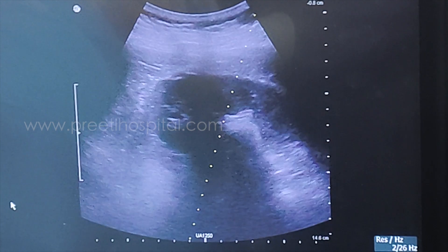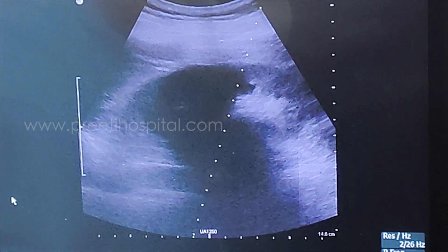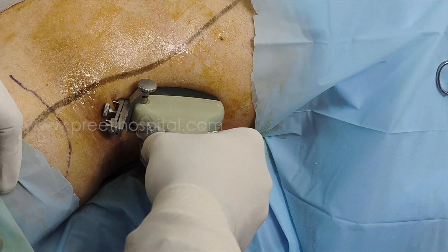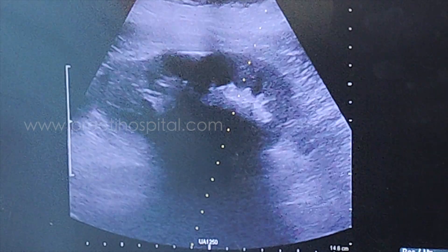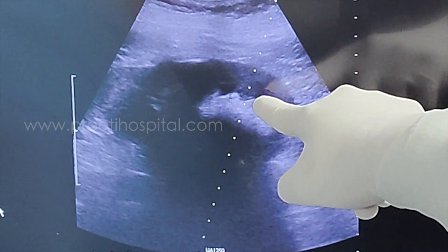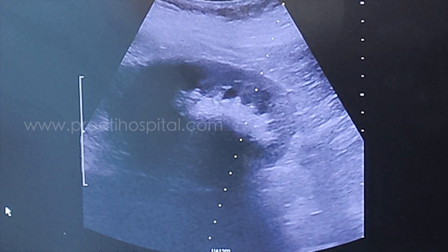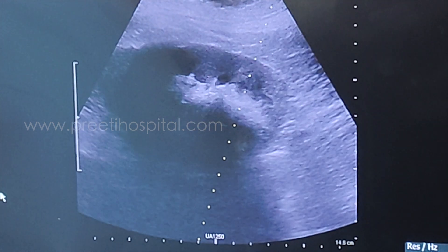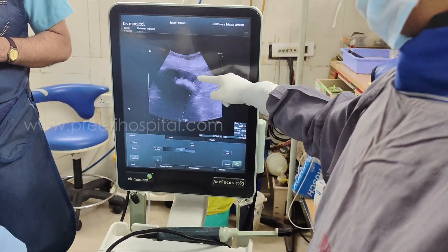Come anteriorly where the stone is seen. As you are going like this, you reach the maximum. At this stage, if you puncture properly — if you puncture at various points here — everything can be reached, because you can go a little lower or a little upper. At this level, if you puncture from this line, 100% the colon is not coming.